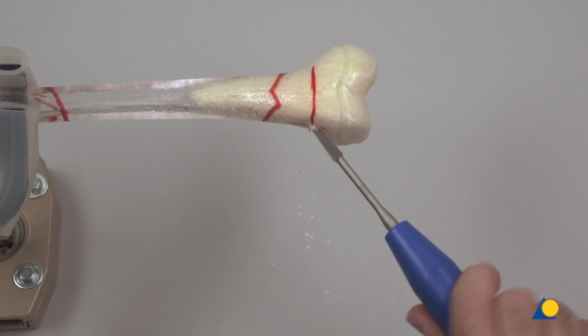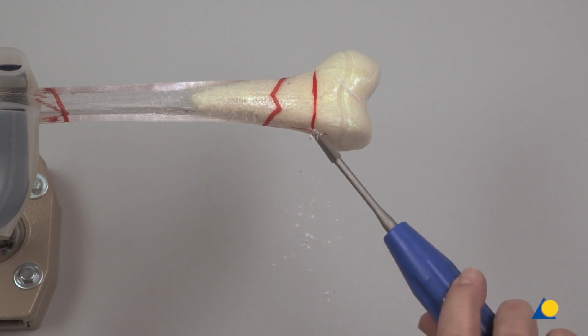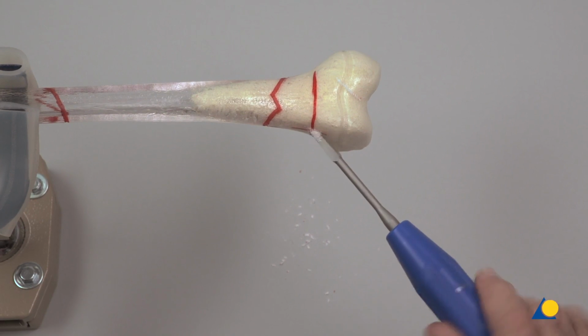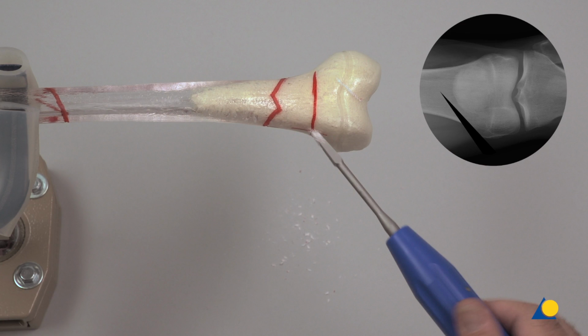The entry point opening must be slightly larger than the selected nail diameter. It is crucial not to penetrate the opposite cortex. When using end caps for the nails, the holes must correspond to the core diameter of the end cap. Clinically, the position and insertion depth of the awl must be verified with image intensification.